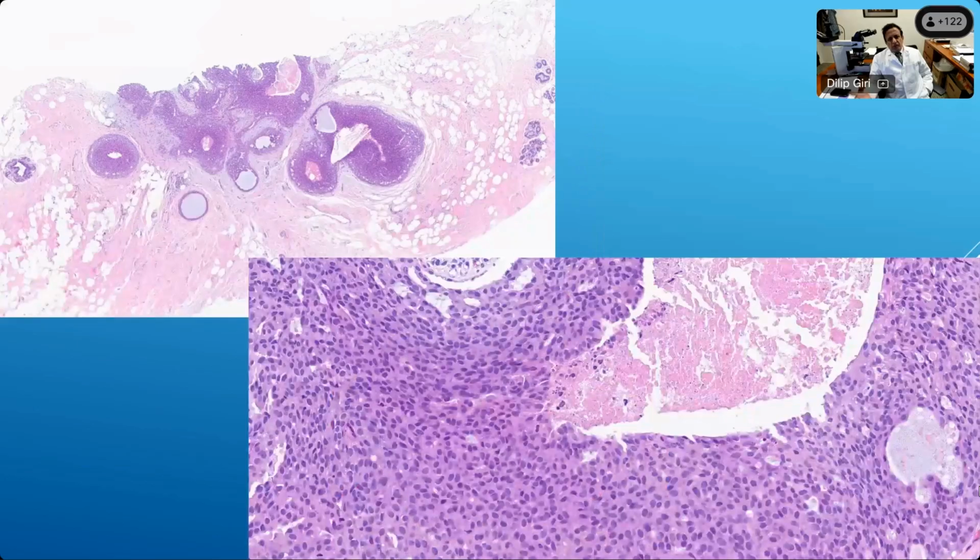Now, just a couple of weeks ago, a case was sent to me in consultation by an outside pathologist who had actually made a diagnosis of DCIS in this particular case. So this is a particularly florid looking ductal proliferation, absolutely expanded ducts which are filled with ductal proliferation.